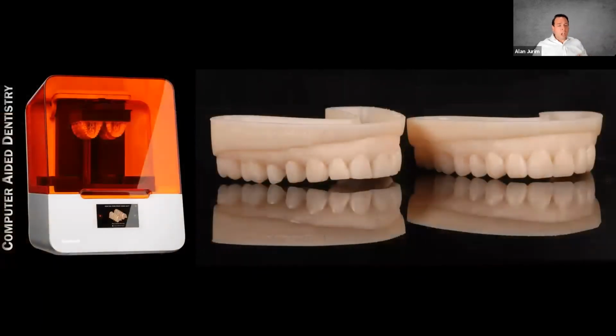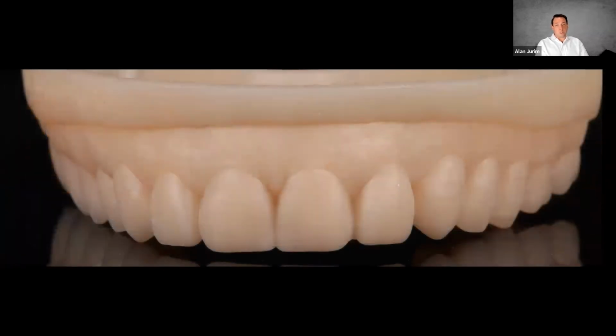And what we use it for is a way to help educate the patient and to educate us. Now, what you see on the left is the preoperative model. What you see on the right is what we call our digital tooth setup model. And the reason why I say digital tooth setup and not wax-up is because that's really what it is. We're designing a new digital smile, a new digital proposal, and then we can take that and print it. And then we can use that in order to, let's say, maybe create an appliance, create provisionals, or even just do a smile mock-up.